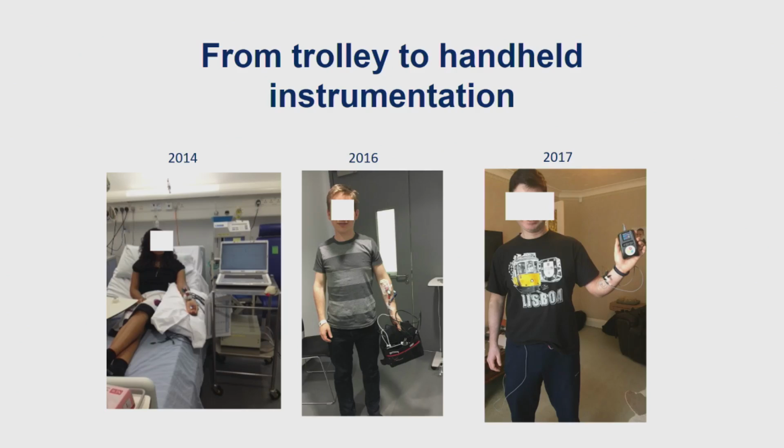I mean, this is an amazing example of how convenient it is to implant these devices, right? When you talk about implantation, and these are invasive, I can feel that they have actually gone under my subcutaneous tissue there, and if I take it out, if it's hit one of my capillaries, I can even show you blood coming out there as well. But it's doing the job. It's sitting in there. There's no bleeding right now. There's no blood coming out, right? It's sitting in there and doing its job quietly, right? Convenience. I mean, cost-wise, it's very expensive, right?